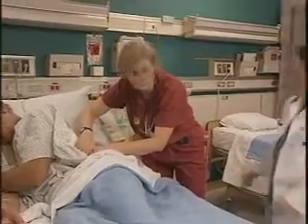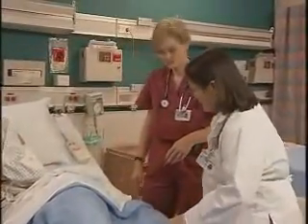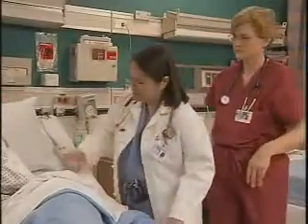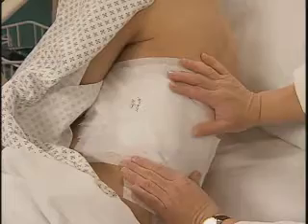How are things going here? Well, actually, doctor, I think there's a little crepitus here. If you detect subcutaneous emphysema, immediately notify the physician, who may reposition the chest tube.